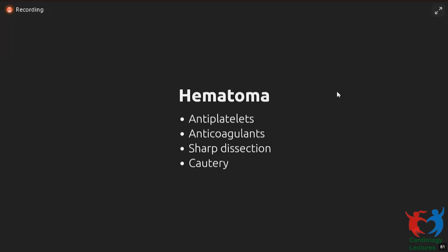Chat, somebody asked, can you please explain lead crush? So what lead crush is basically, you'll experience this if you do subclavian punctures, especially, like I said, if you put a roll of towel between the shoulder blades, and then you do the subclavian puncture, and your needle actually passes through the costoclavicular ligament.